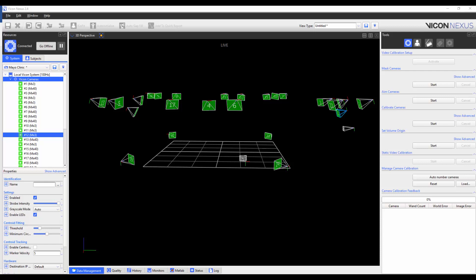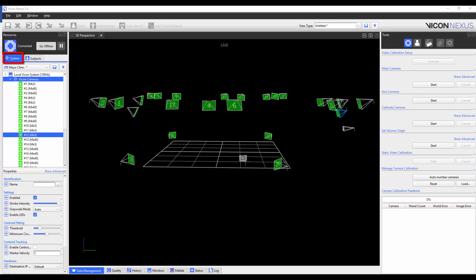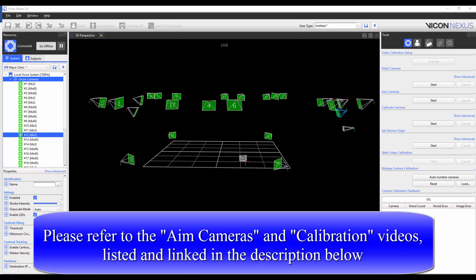To use this feature, please ensure that you are in Live mode, that all cameras are listed in the Resources pane, Systems tab, and that you have the cameras calibrated or aimed.